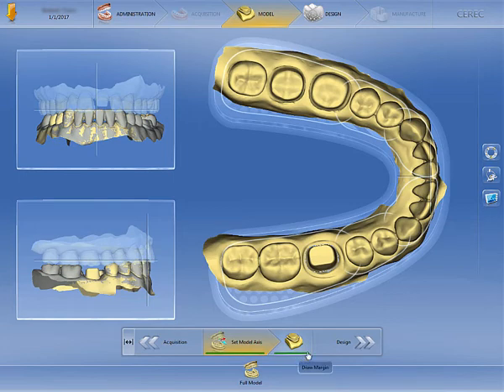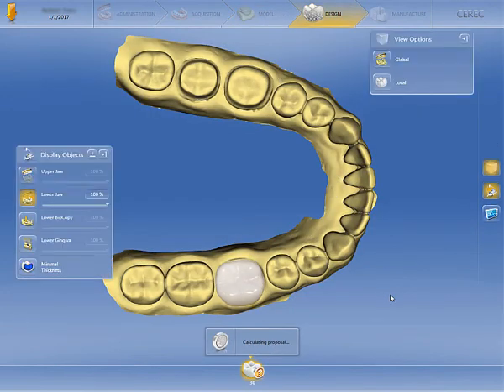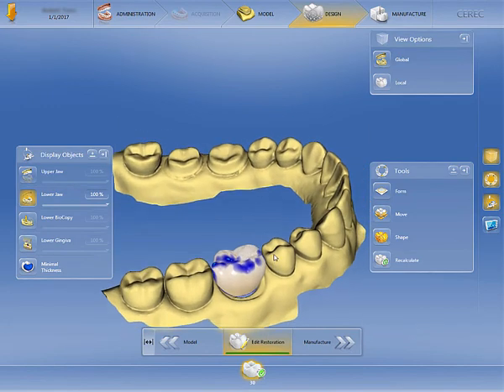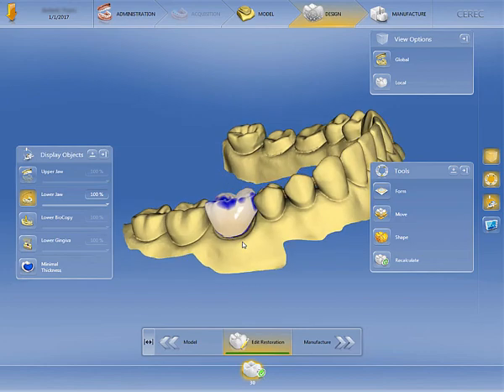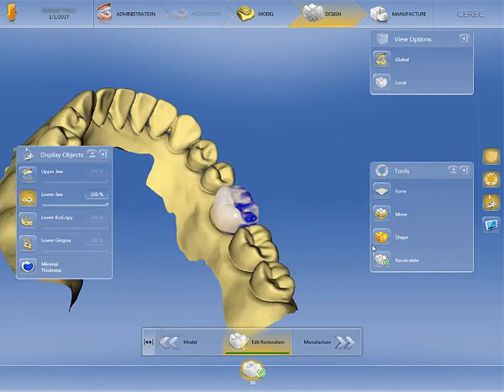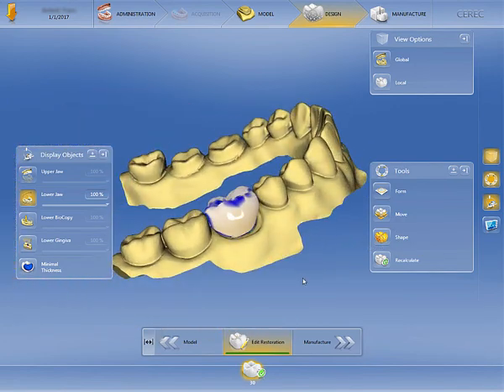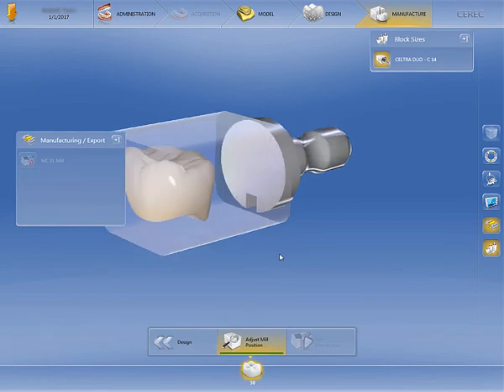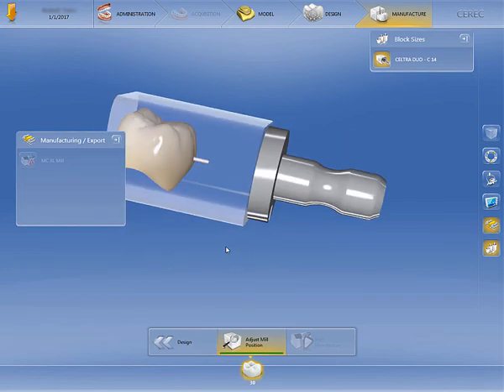We can move directly into the design phase. From here, you'll be able to design your restoration as you would with any other CEREC case. Use any of the tools available to create the exact design you want. Once you're done with the design, click Manufacture. Set the restoration in the block how you desire it, and then you're ready to mill.